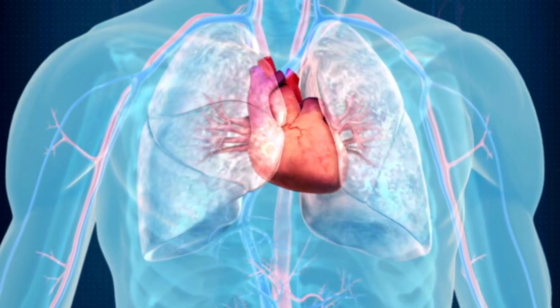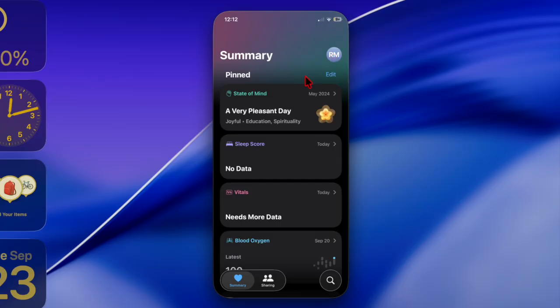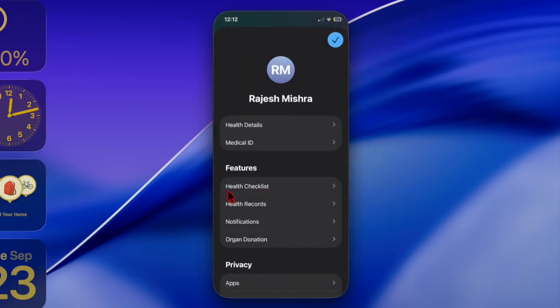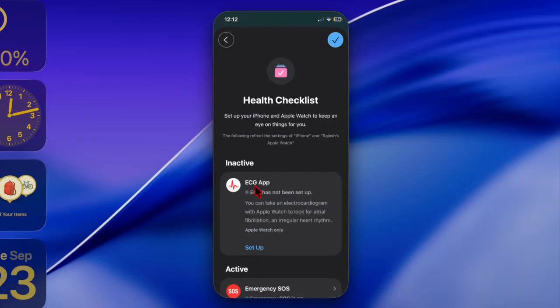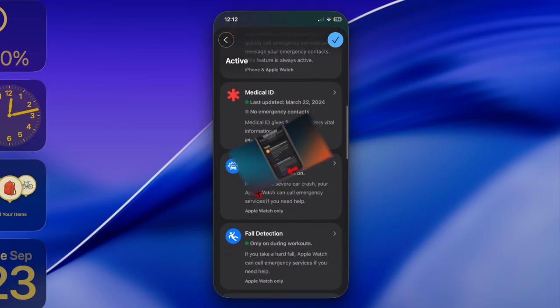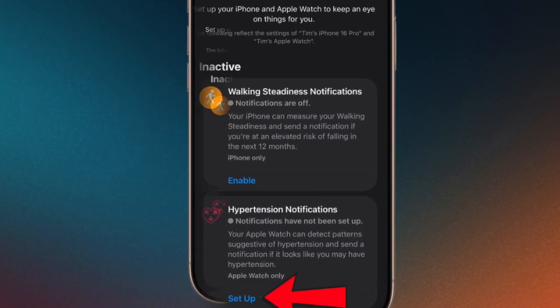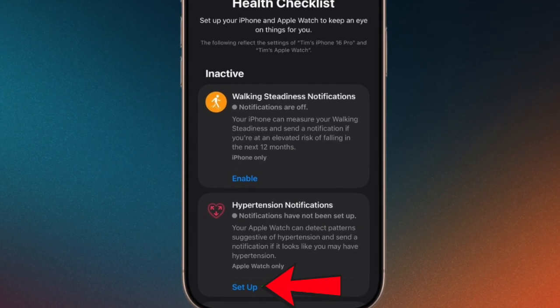Once you have taken care of all the requirements, open the Health app on your iPhone running iOS 26 or later. Tap on your profile photo located in the top right corner of the screen, then choose the Health Checklist option under the Features section. Find Hypertension Notifications and tap the Setup option, then follow the on-screen instructions to complete the activation.